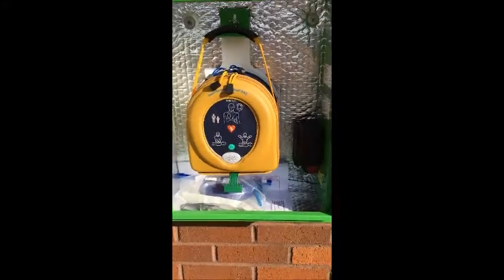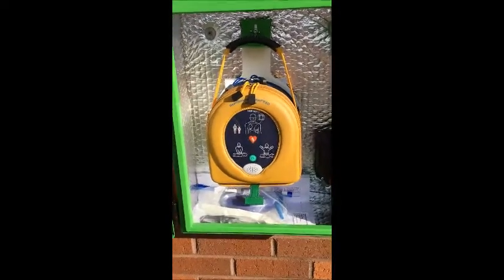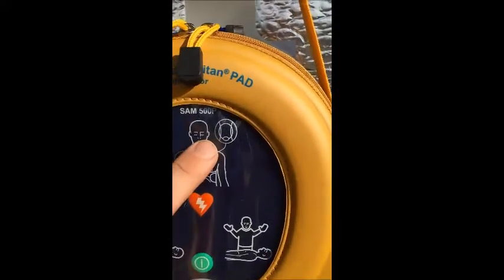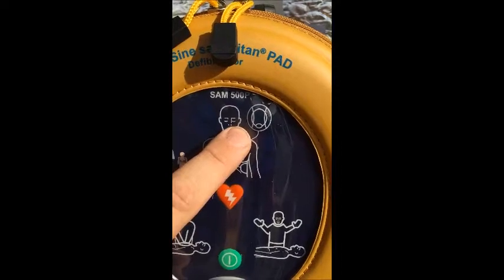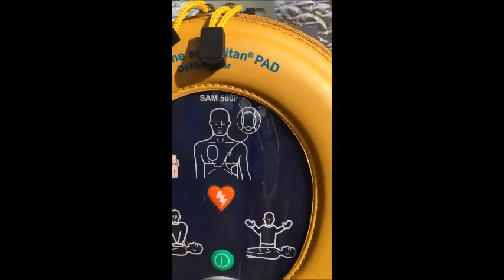The next question concerns the defibrillator itself, making sure that it's functional and emergency ready. On this Heartsine Pad 500P, we're looking for a green flashing LED just here. There we go — that indicates that it is ready.